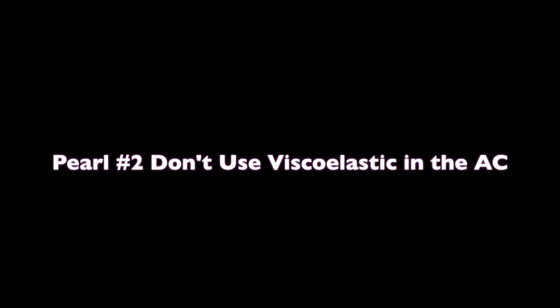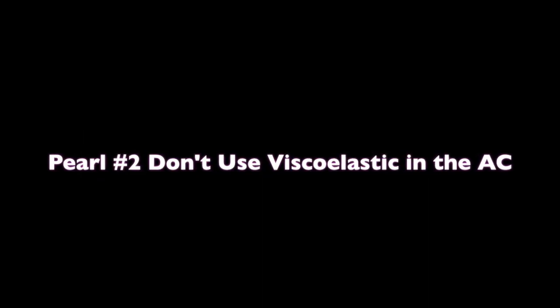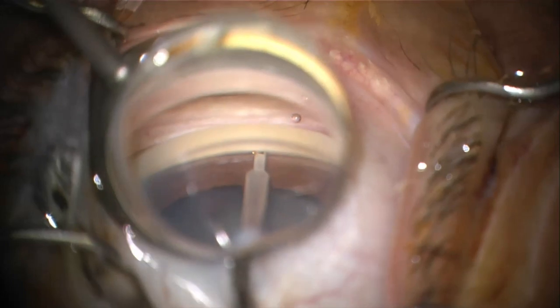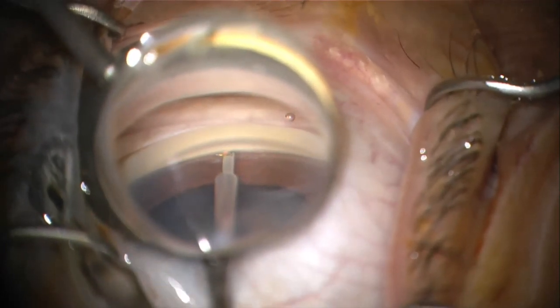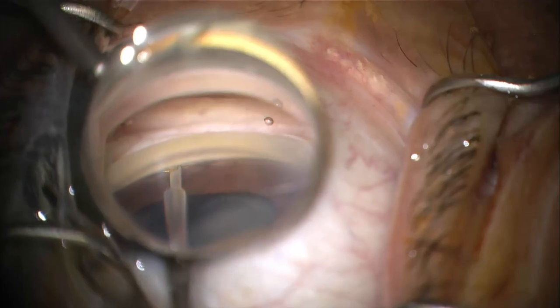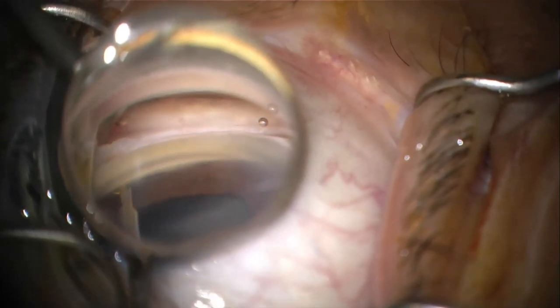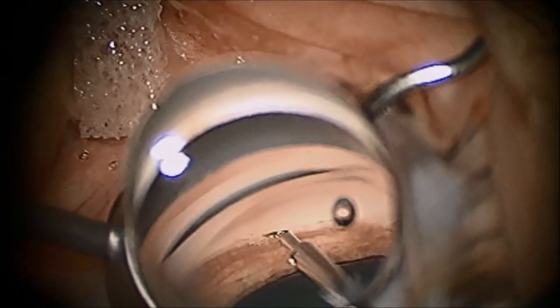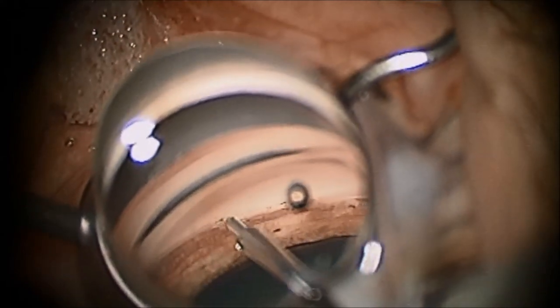Also, another pearl or warning: make sure not to use viscoelastic in the anterior chamber for the Trabectome surgery. Some may consider using this to keep the chamber maintained. However, the ablation energy works best with saline solution and viscoelastic can have a negative impact on its effect. Another pearl is that resistance or significant movement of the eye in the direction of the trabecular meshwork ablation may indicate incorrect positioning and that the tip is inserted into the scleral wall.